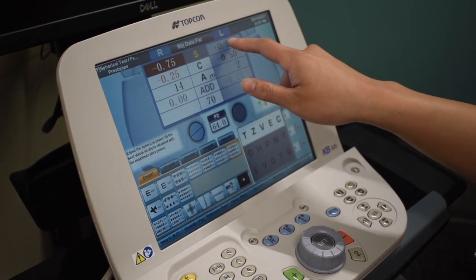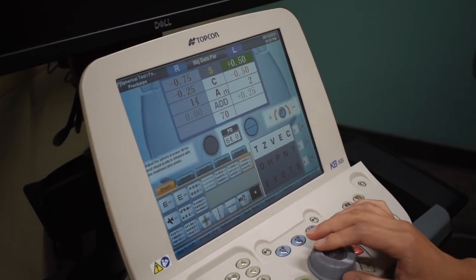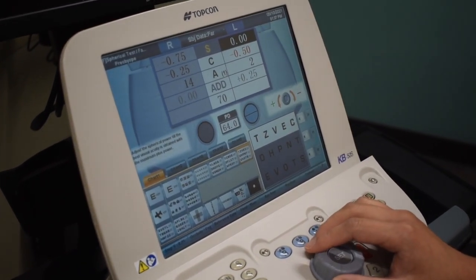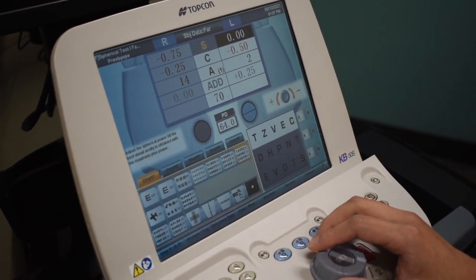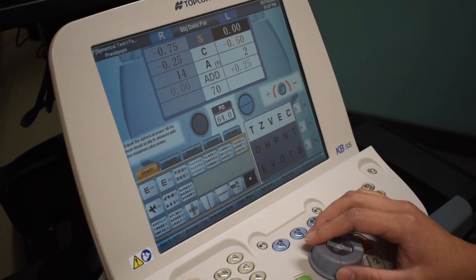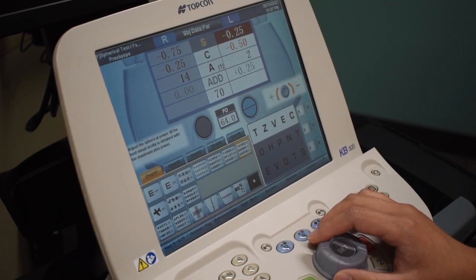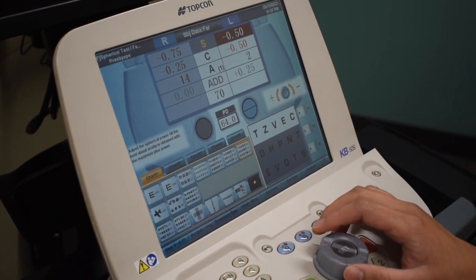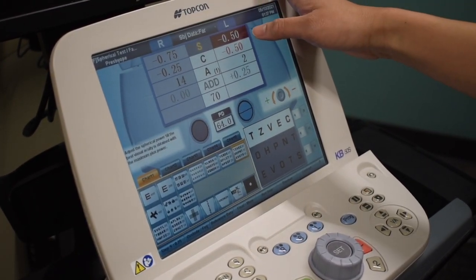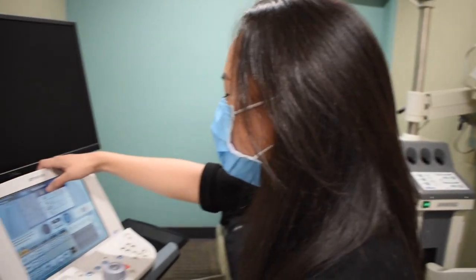Now we're going to move to the left eye. Are those letters pretty blurry? Tell me when you can see one or two of those letters. Patient says he can see all of them actually. Is one or two better? One. How about three or four? Three — just clearer. We're going to stop at minus 0.5 from that line because he saw all of the letters there.